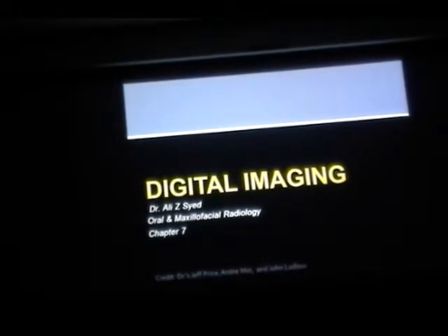So they did studies. Again, I'm not going into the literature review because I don't want you to be radiologists, technically. They looked at different lengths and came up with 6 and 12 inches. Those are the standards. They said this is the best one. They put cameras to look at where the X-rays are coming, spotted those things, and decided.